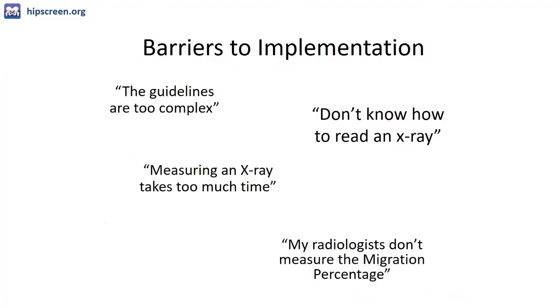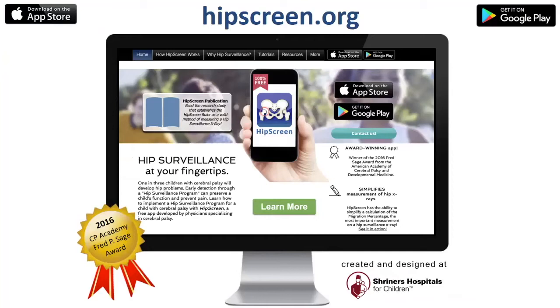Well, it's to address some of these barriers to implementation that the HipScreen app was developed, and its companion website, hipscreen.org. So I recommend that you download it for free to your device through the Apple App Store or Google Play.